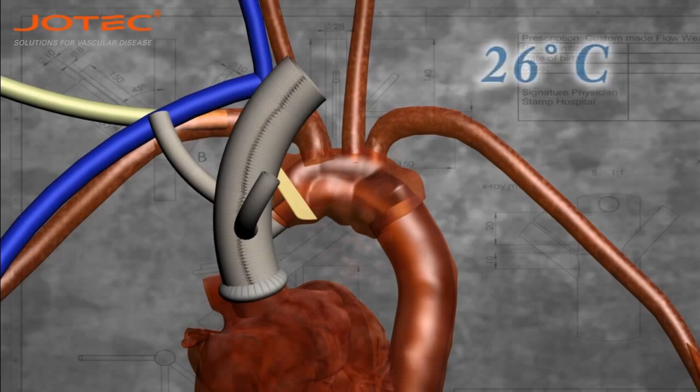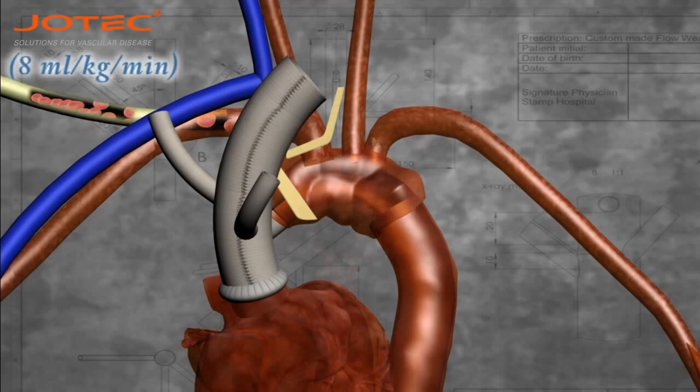Once the patient reaches 26 degrees Celsius, proceed with the circulatory arrest and the clamping of the innominate trunk. The right carotid artery will be perfused through the cannula placed in the right axillary artery.